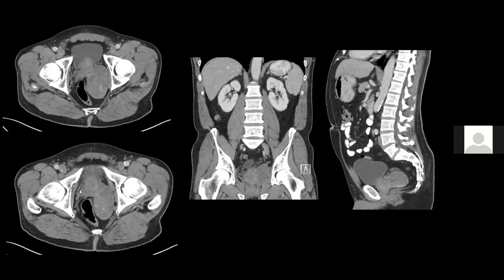Can I pitch in? I've seen this scan. It was shown as an interesting case as well. Earlier, the seminal vesicle was displaced medially. We don't quite see that image on this particular axial image that has been chosen. But if you scroll through the scan, the seminal vesicle was separate and it was pushed medially, and you could see that this thing arose from the prostate. I see. Now I want to see the MR even more. Maybe we'll just get it for satiating our curiosity. But I also think that, like she's saying, if they have glioblastoma, this is not going to be pursued, and because stump, we don't even know, it's of uncertain malignant potential. Right? Oh yeah, totally. There's a bigger fish to fry. Okay. Cool. All right.